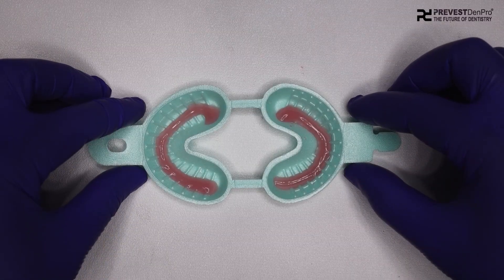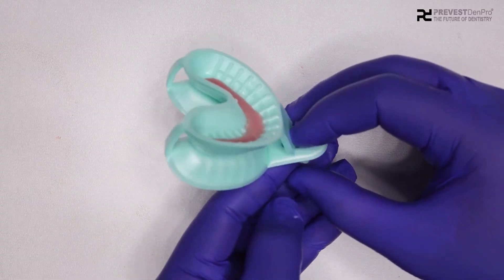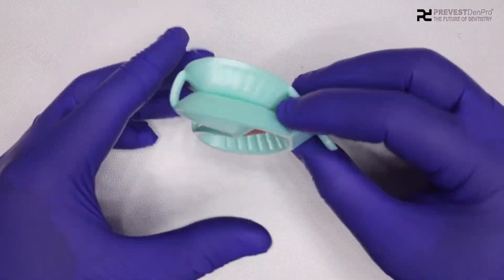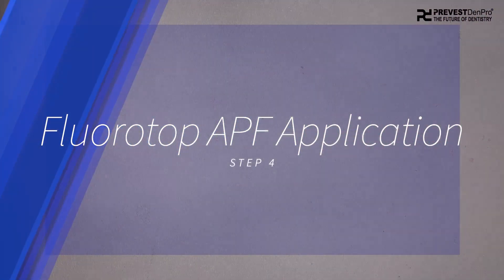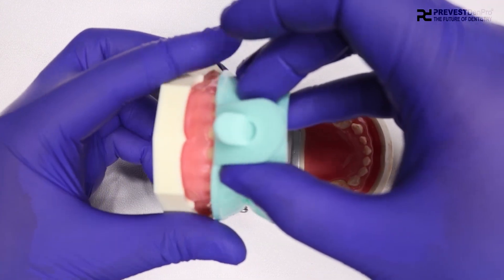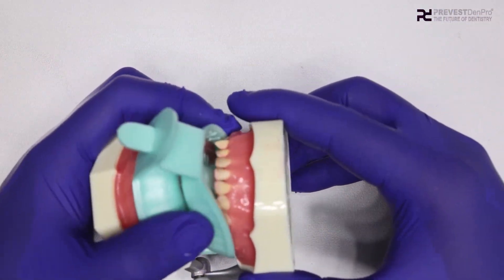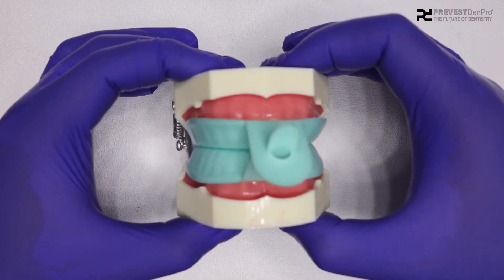Fluorotop APF is a highly viscous and thixotropic gel — that is, it won't fall off even when the trays are inverted. This helps in keeping the teeth soaked in the gel for a longer duration. In the fourth step, insert the tray into the patient's mouth and instruct them to bite down gently for at least 4 minutes.